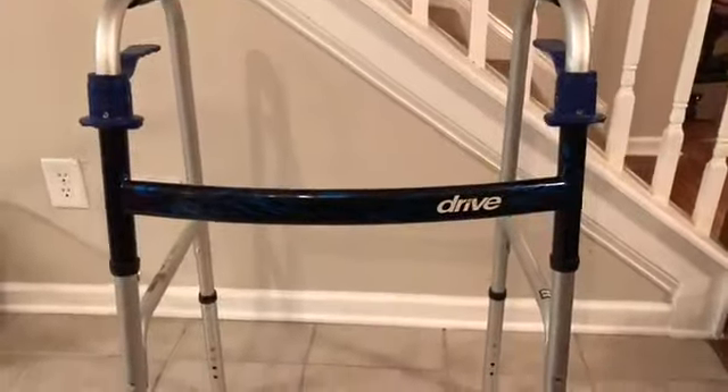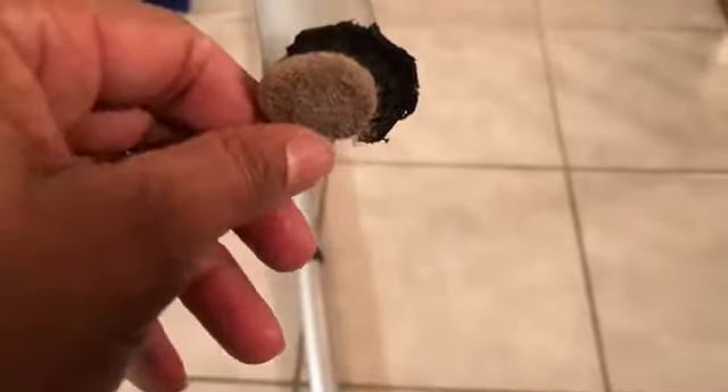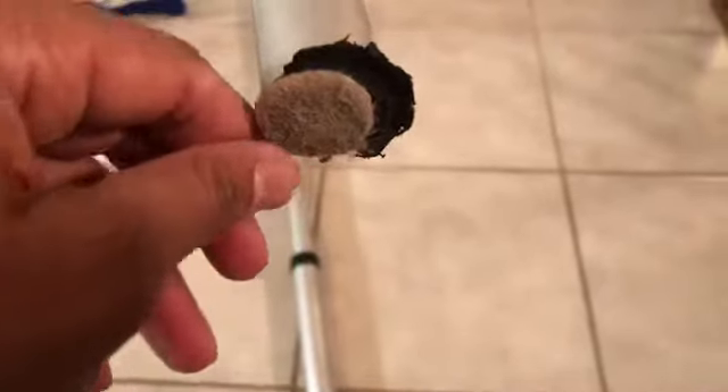You can see this is my mother's drive walker. I previously added some little felt tips that go on the bottom of furniture, but now I've got the kind she's supposed to have. Let's see how difficult it will be to get these off.